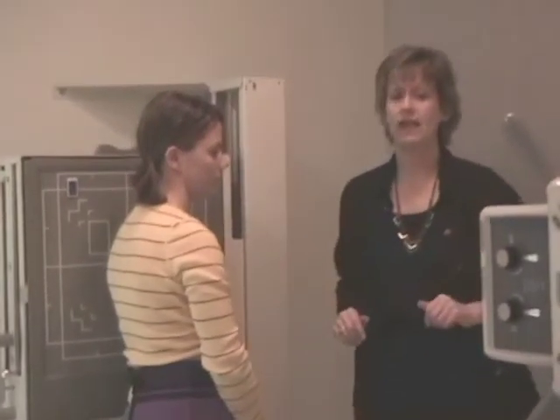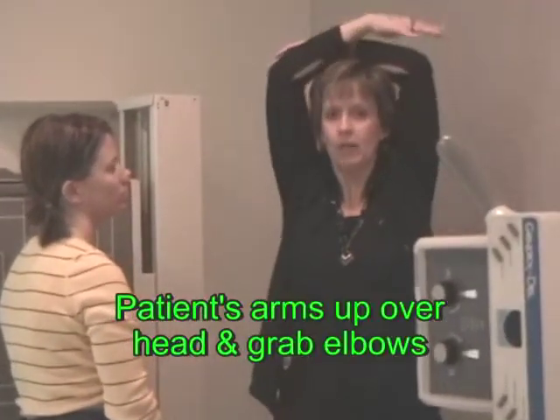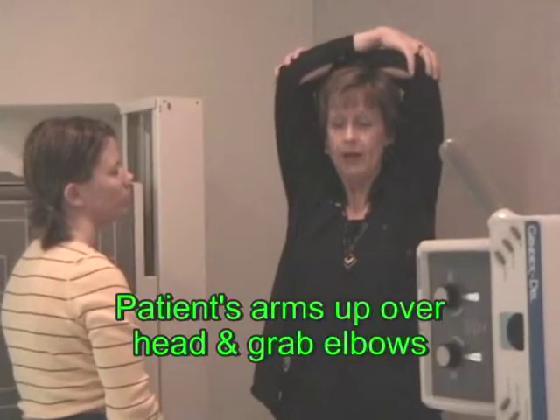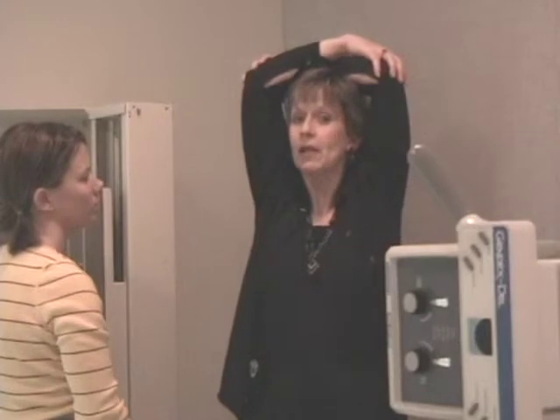Now, this is the ideal situation. Bring the patient's arms up over their head and have them grab their elbows. Now, I want you to do this to yourself. Now elevate your chin. Okay? And now hold it for the minute that it takes. You're going to find that that's very uncomfortable for some patients, especially if there's problems with muscles in the body or they're sick. So in reality, that was the textbook perfect scenario.